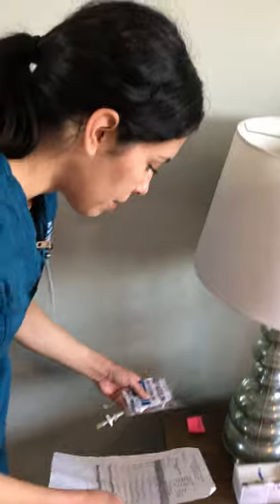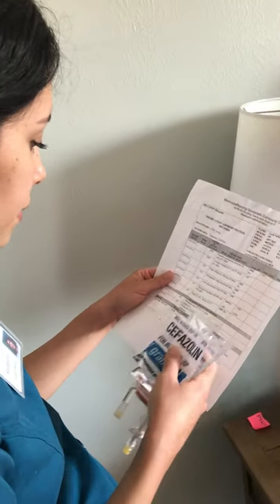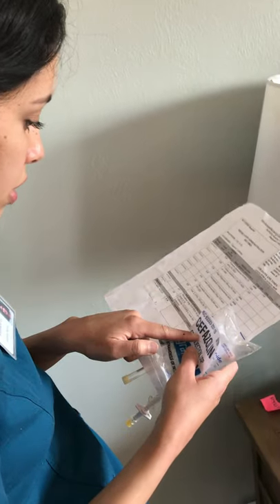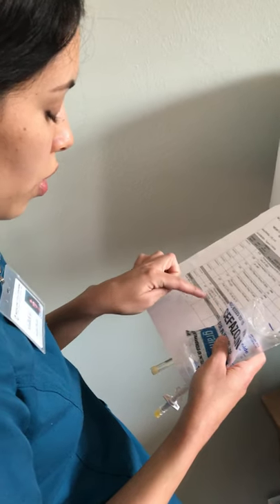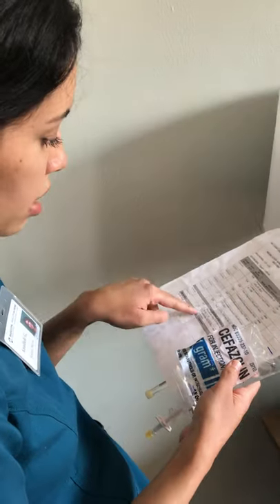I'm going to start by coming to the Pyxis and doing my first check. This is for patient Lotta Fallings, date of birth 10/5/XX. Her order reads Cefazolin 1 gram IV piggyback times 1 now for infection. Here I have her Cefazolin 1 gram IV piggyback — correct route, times 1 now, correct time, for infection. And this is not expired.